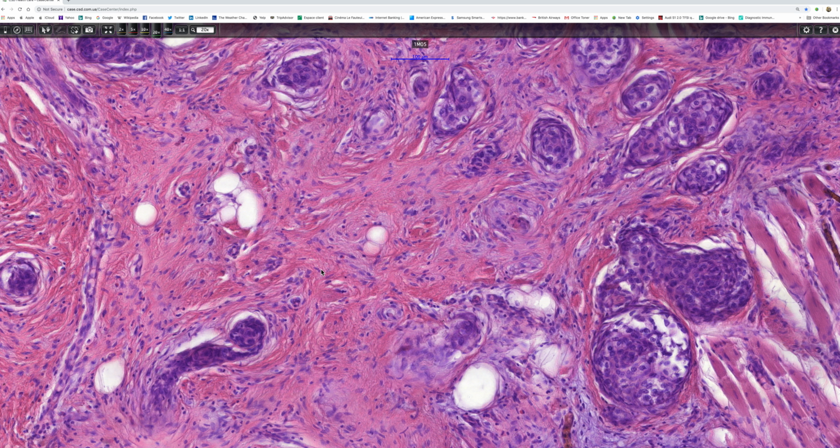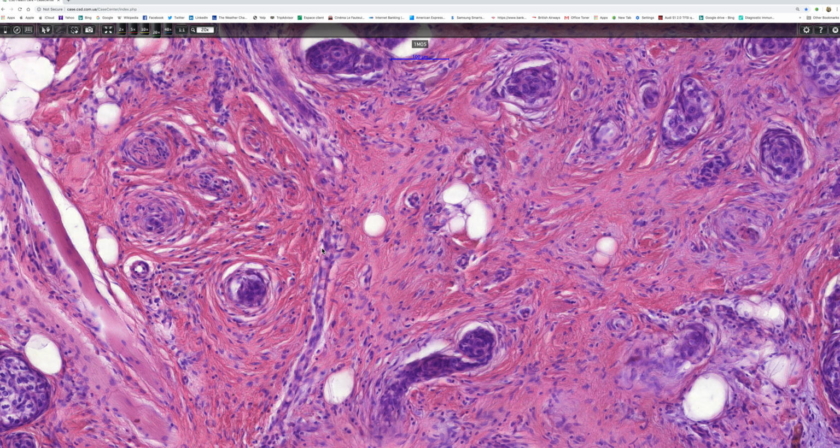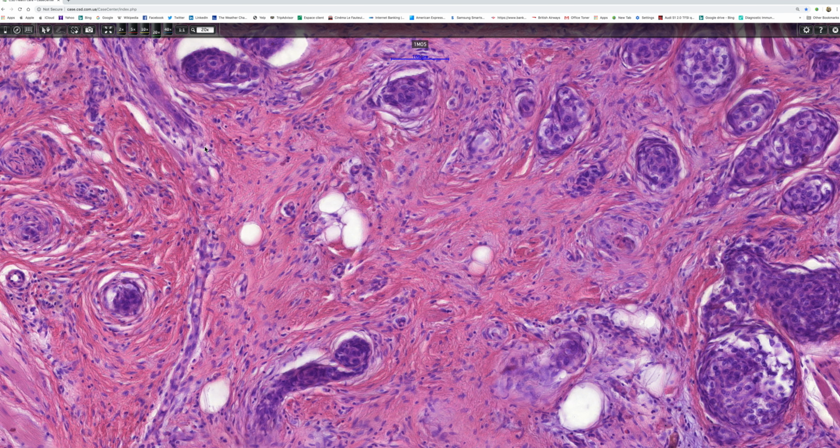When one hunts around, one comes across these structures here where there's a vacuole with a rather nice hyaline membrane around it. They're forming a double one. I think that's probably a duct. The only option is it could be that it's incorporated the edge of some fat cells, and I can't dispute that. But there's another one there. And again, we've got this very nice membrane around it. So I think it's worth wondering about whether those are ducts.